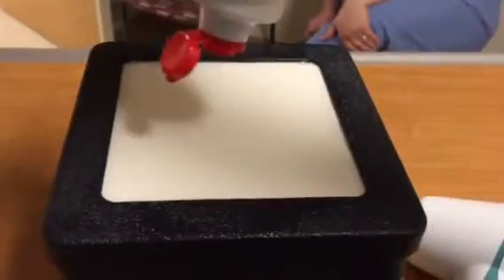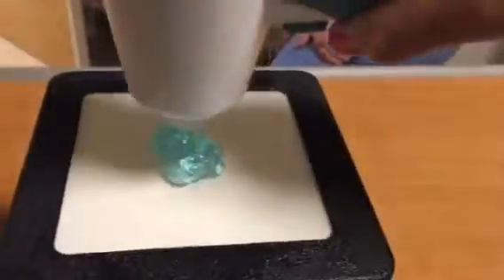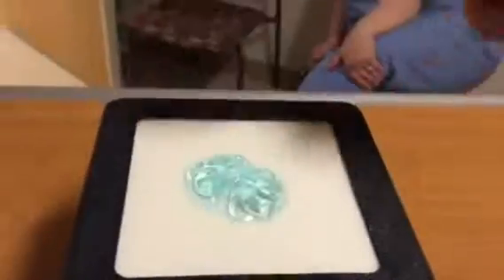Okay, amount of gel that needs to be used. So then the entire probe is covered with ultrasound gel.